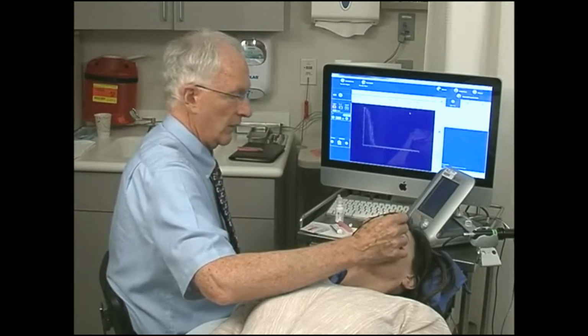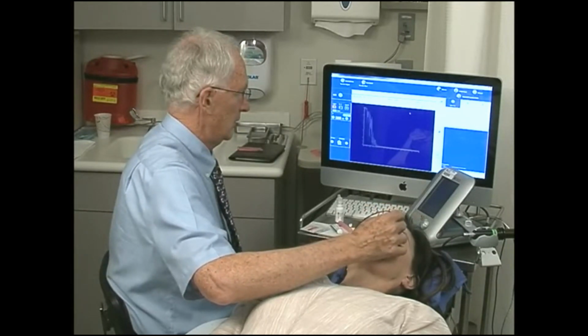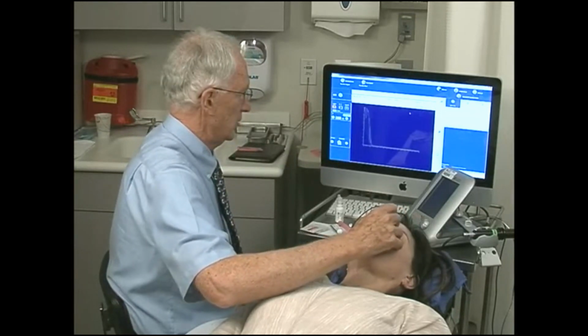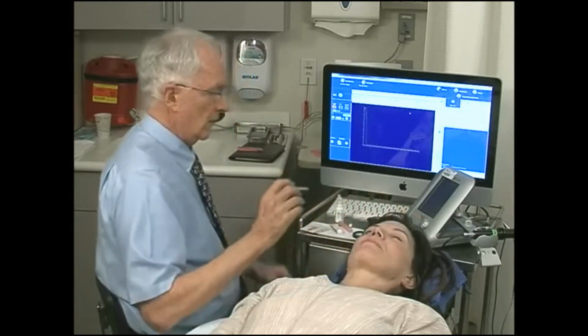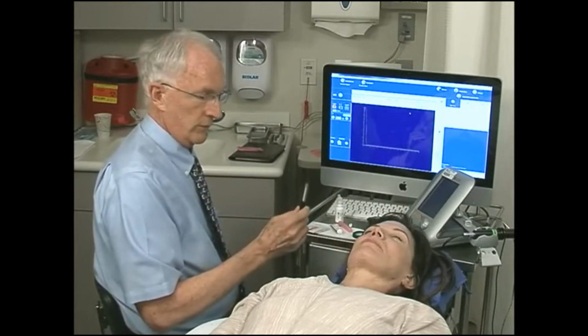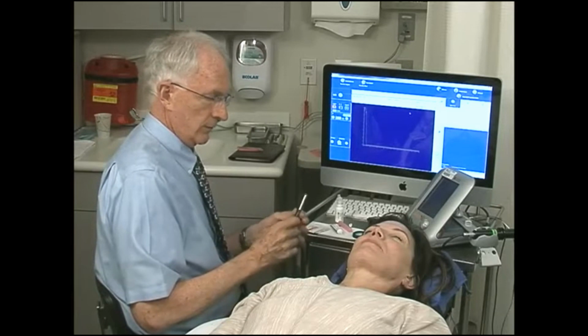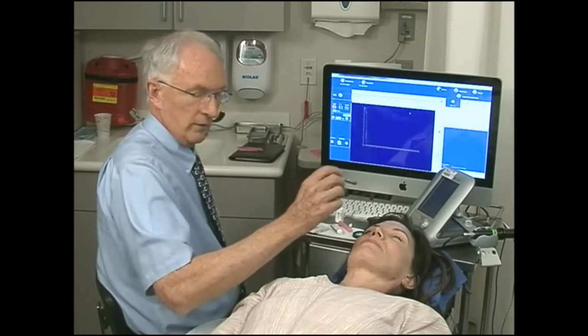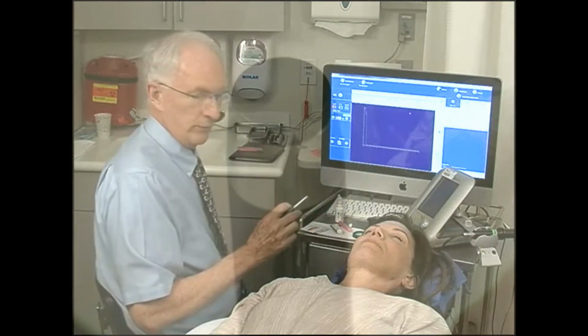I'm going to 10 o'clock, the orbital pattern here, and 8 o'clock, the orbital pattern here. So by doing that, I've done a paraocular approach to show the orbit, because sometimes orbital lesions are quite anterior, and they can't be displayed unless you show this kind of approach.